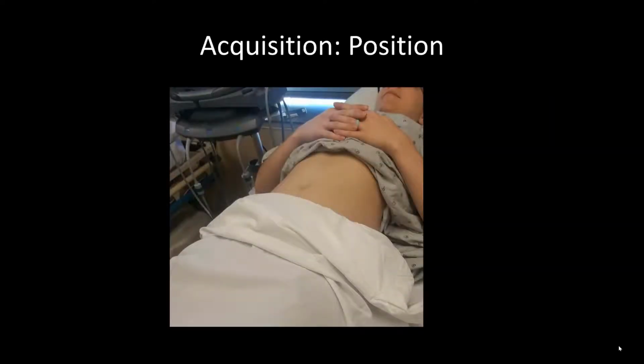Before doing this exam, ideally your patient should lay supine. However, if they are unable to tolerate this secondary to pain or other situations, they may be examined in a semi-upright or lateral decubitus position. In addition, if you are unable to find the gallbladder, the patient may be placed in the left lateral decubitus position, bringing the gallbladder closer to the anterior abdominal wall and displacing the bowel gas.